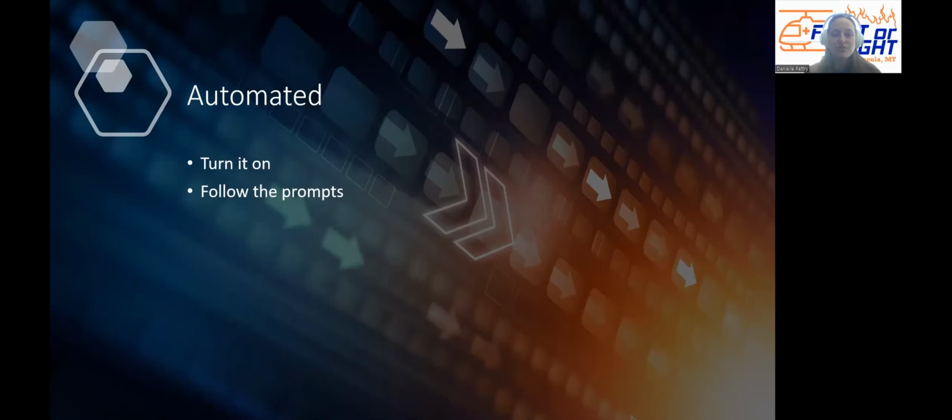From there, it's really simple. You just want to follow the prompts. Just listen to what it tells you and do what it tells you. I used to go more in depth for students on this: you're going to apply the pads first and then stand clear while it analyzes and then do this and that. And really, the AED technology is changing faster than I can teach people now. Your CPR card is valid for 2 years. And in 2 years, the technology is going to be doing who knows what.